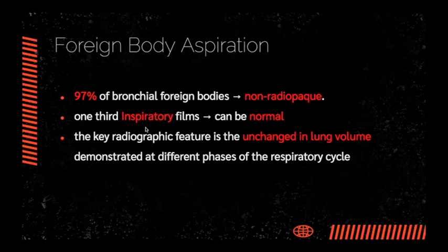One third of the inspiratory films can be normal, and the key radiographic feature is again unchanged lung volume.